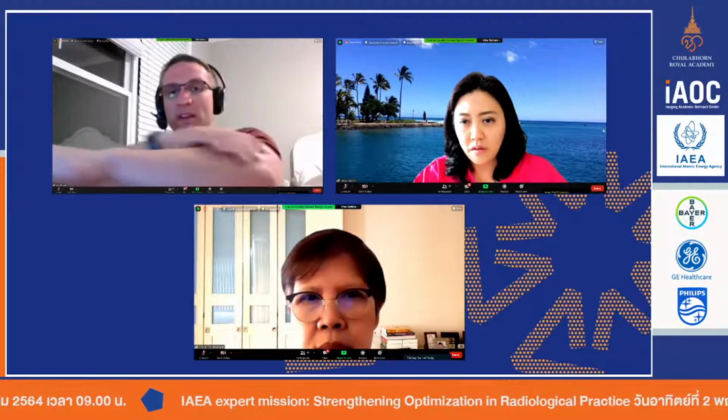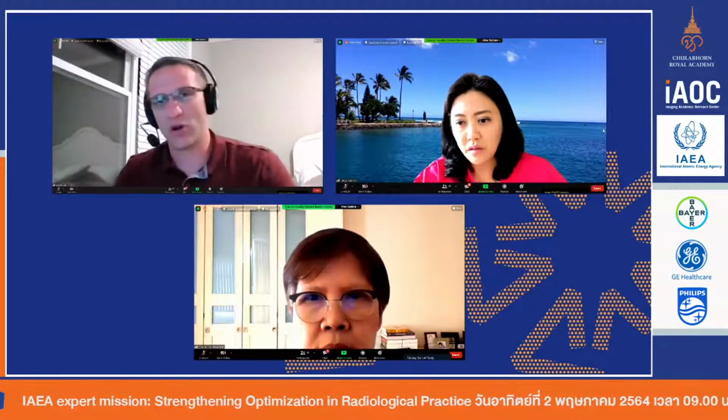For the extremities, for arms and lower legs, no. Extremities, obviously through pelvis or shoulder, yes. It's a lot of material. So you have to use your judgment. If there's going to be a lot of scatter that can happen, then you're going to want a grid.